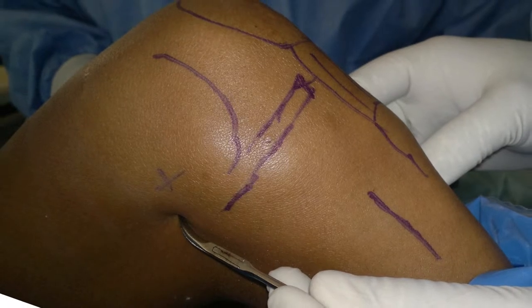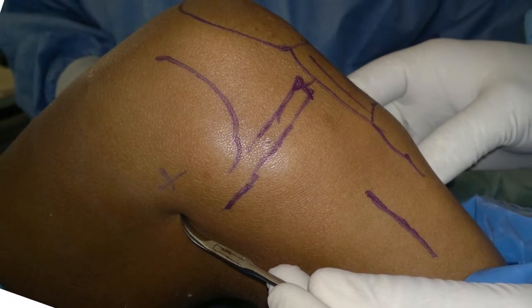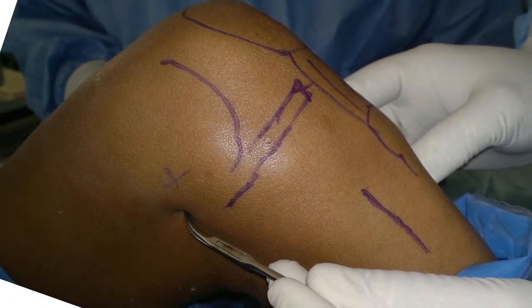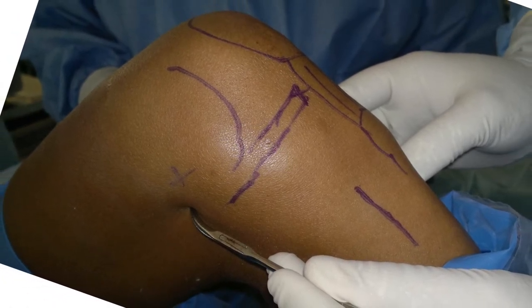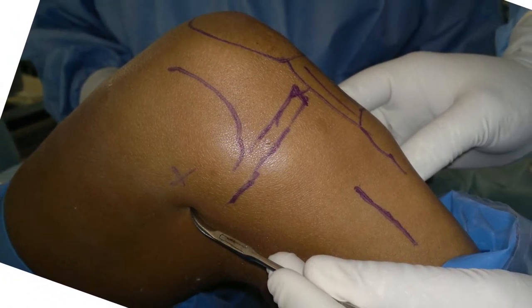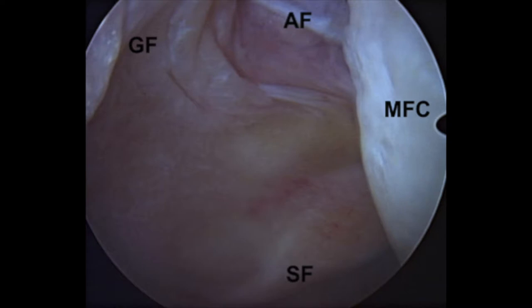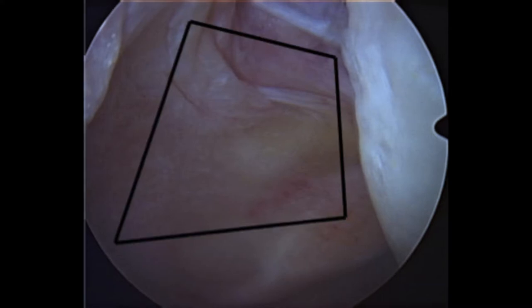A key point of this operation is making of the posteromedial portal, which is made just posterior and inferior to the medial epicondyle. The posteromedial corner of the knee joint has four distinct synovial folds, and one has to identify these folds. That is the safe area where the PM portal can be made.